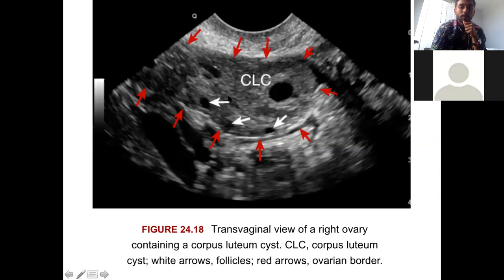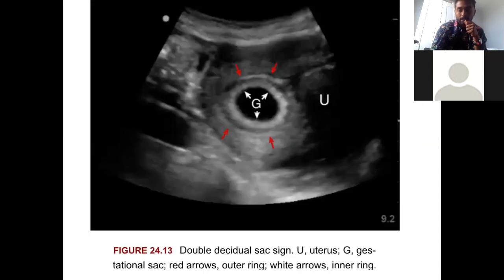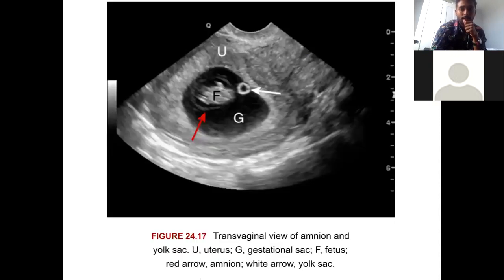All right, and then if you're going to ask what view this is, it's probably going to be a sagittal view because I think this is the external iliac vein. Like I said, it kind of goes lateral to it at one point. But I wouldn't worry about what view this is. And these are most likely all sagittal, except this one is probably going to be a coronal or transverse view because it's a short axis. But all these, where you can see the entire long axis of the uterus, are going to be sagittal views. This is probably short axis, so it's probably going to be a coronal view.